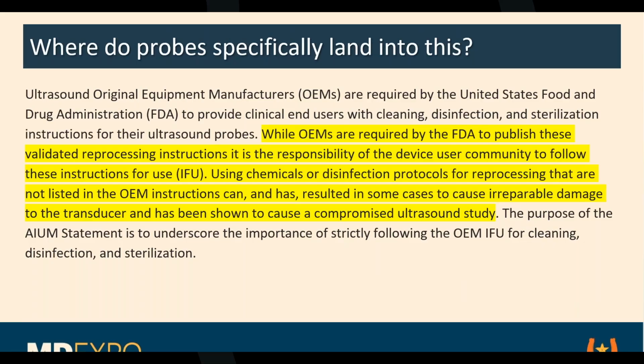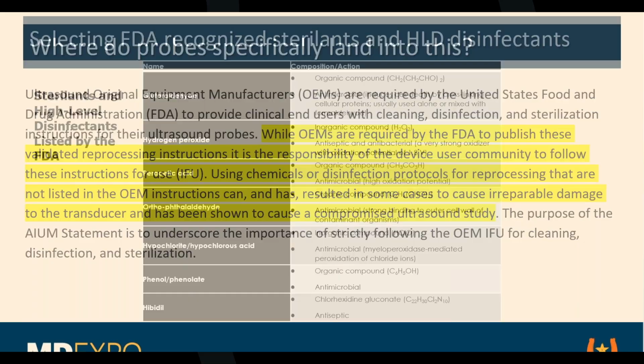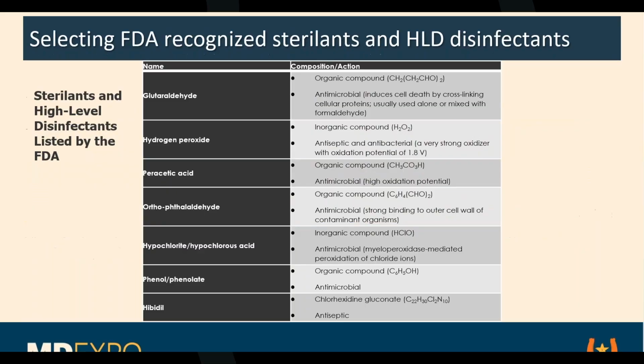Using chemicals or disinfection protocols for reprocessing that are not listed in the OEM's instructions can and in some cases has caused irreparable damage to the transducer, and has been shown to also cause a compromised ultrasound study. So the FDA recognizes, like I said, sterilants and HLD disinfectants, and there's just a little list of them right here.